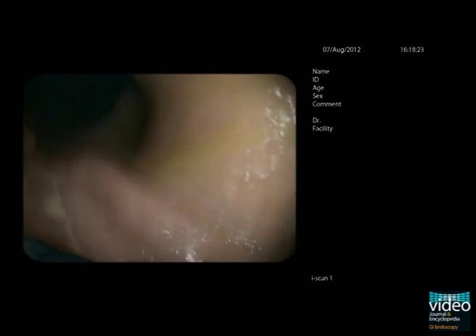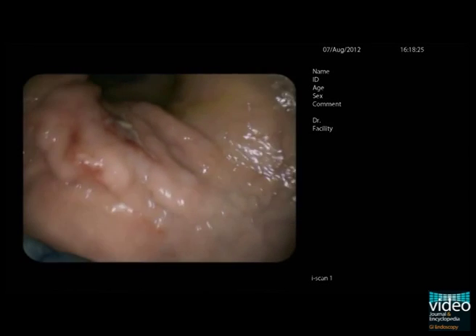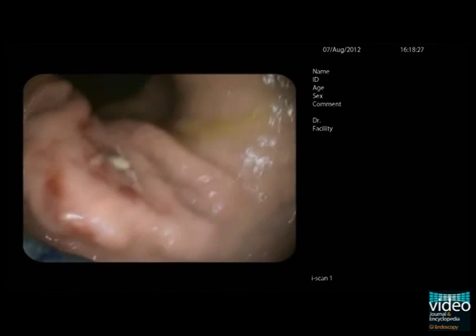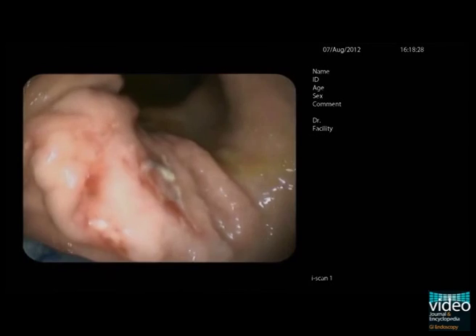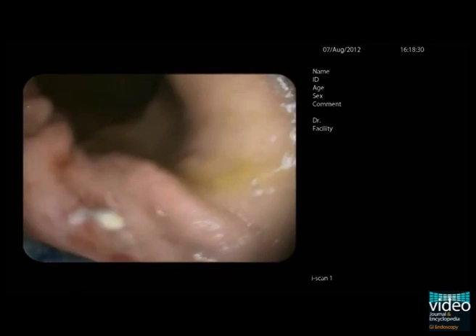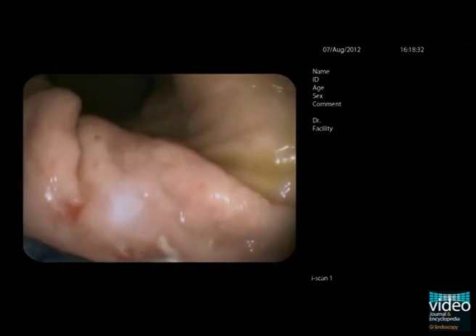In this patient, a gastric lesion was found partially within a hiatal hernia. It had a central ulceration. Close-up view revealed villous and irregular surface patterns.